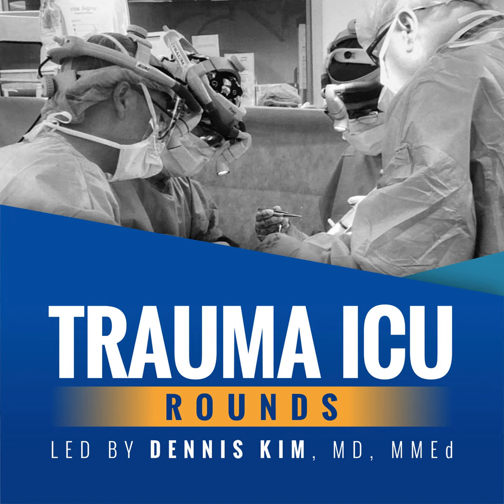So when it comes to the basic approach to figuring out, can I extubate my patient or not, there are really two big questions you need to ask yourself. The first question is, can my patient breathe on their own without the ventilator, or with the absolute bare minimum support from the ventilator? In other words, can my patient be liberated from the vent? The second question is, can my patient breathe without the endotracheal tube, or can I safely extubate my patient? If the answer to both of these questions is yes, then immediate discontinuation of mechanical ventilation should ensue.